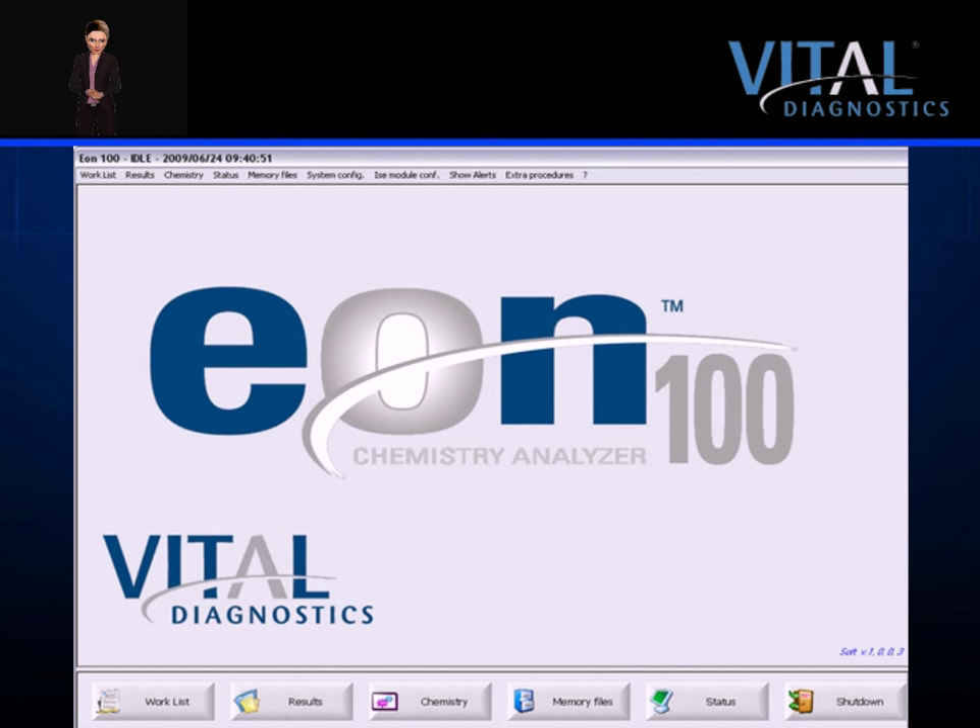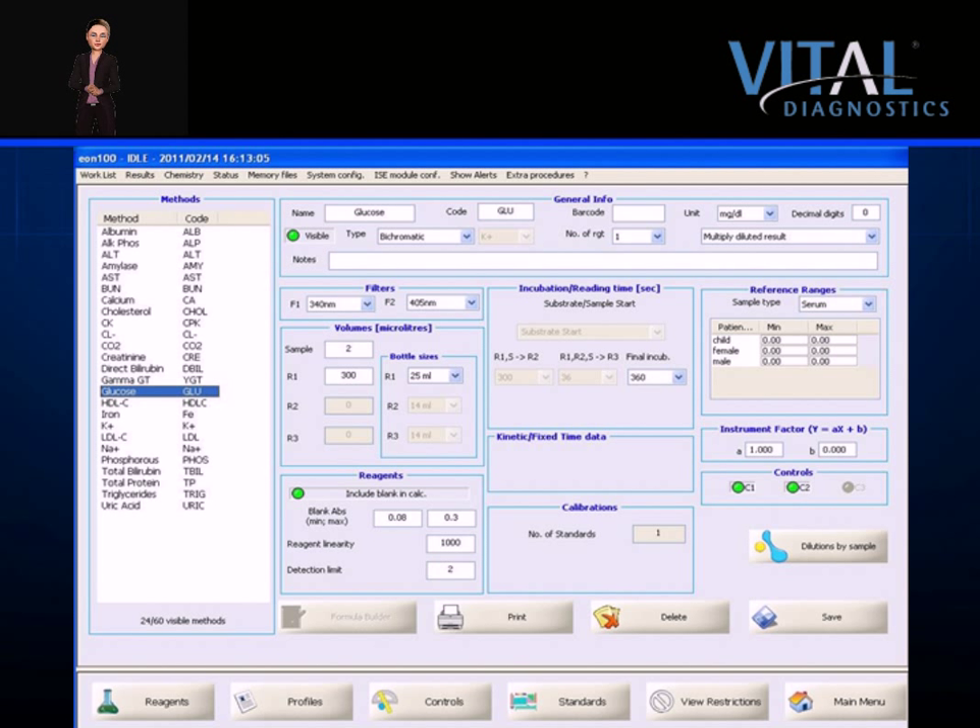The chemistry menu is where reagents are managed, test applications are stored, and profiles are configured. Controls, calibrator set points, and reference ranges are programmed in this menu. Information can be viewed, stored, printed, or modified by one click. The system features restricted access by user to help protect vital information; users with administrator access only will be admitted to this screen.